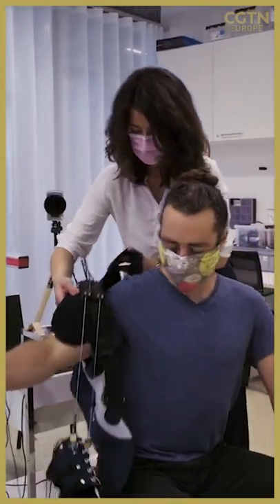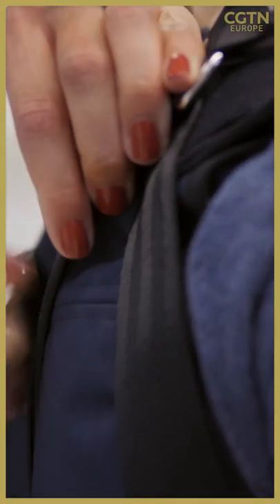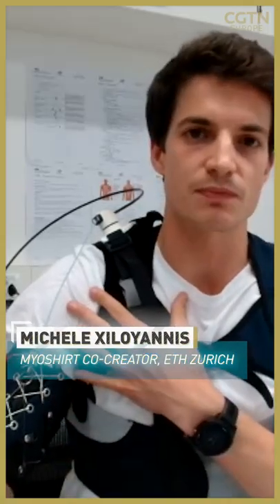The Myoshirt works like an external layer of muscles to assist people who have disabilities in the upper limbs. It does this through a set of textile components attached to the trunk, to the upper arm, and to the lower arm.